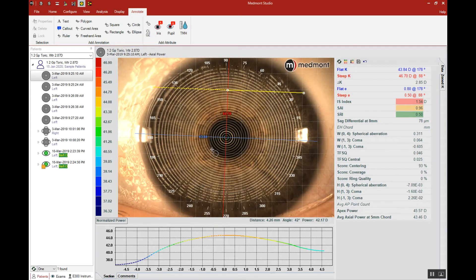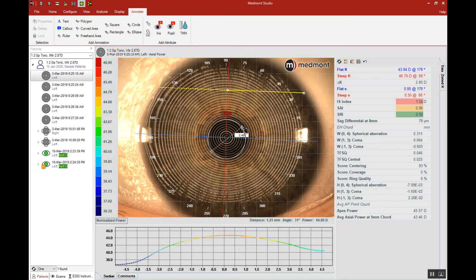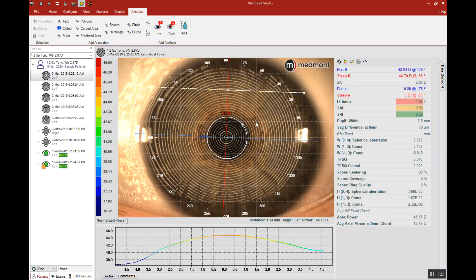We'll take that cursor and put it right on the border of where we believe the iris and pupil meet. Then we'll click and drag the circle across to the other side, making sure that we have the circle aligning for the most part 360 degrees around. Then we release and our pupil is defined — notice you have a 2.6 millimeter pupil.